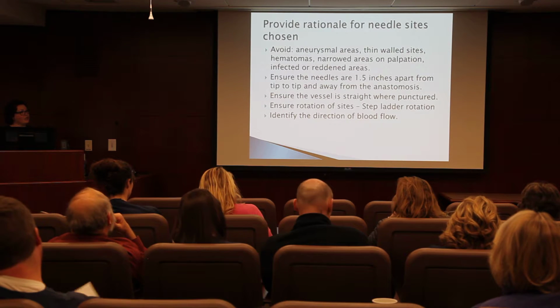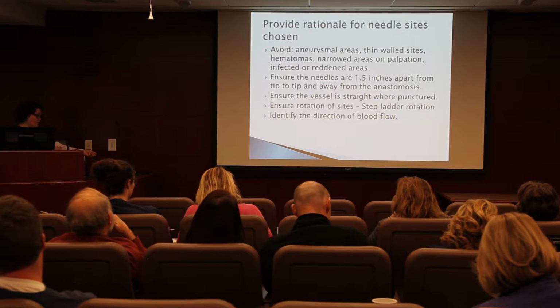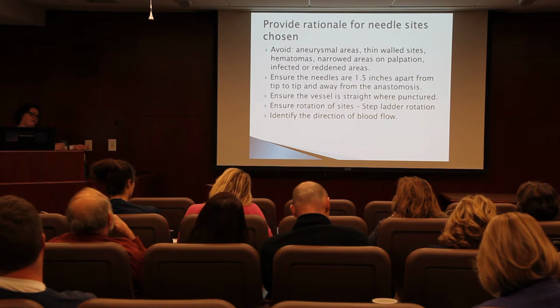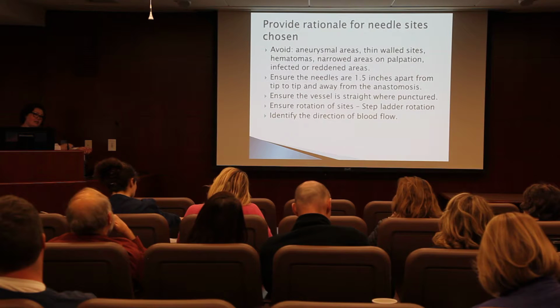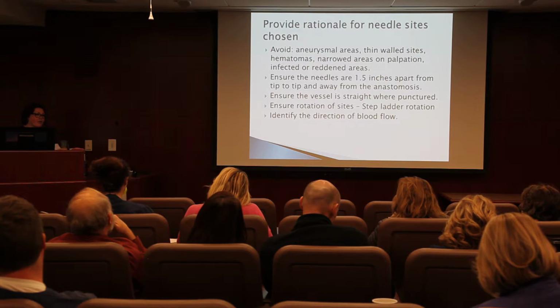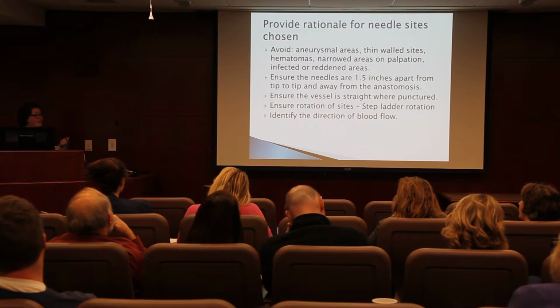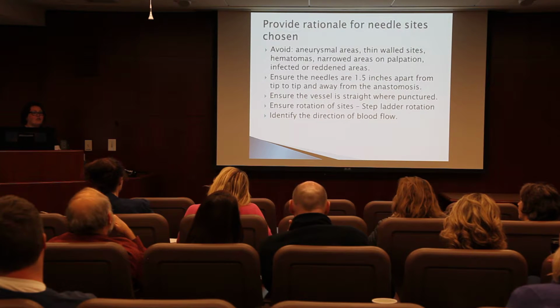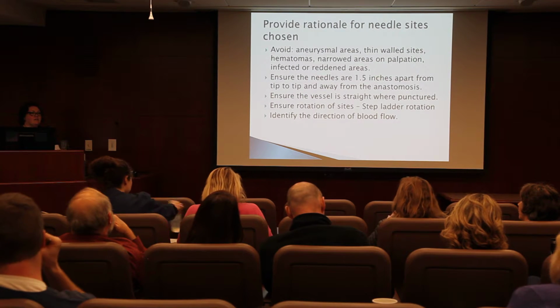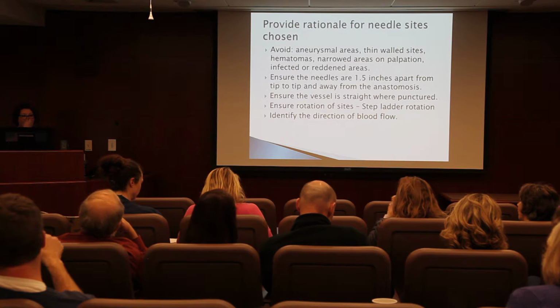And then rotate your sites. If you have a fistula that's, from here to here, use the whole thing. Even though some people are sticking in that aneurysmal area, if you're feeling comfortable enough, go elsewhere. You make use of that whole site. Some people, especially if they're dialysis patients, that's their lifeline. So we want to protect it.